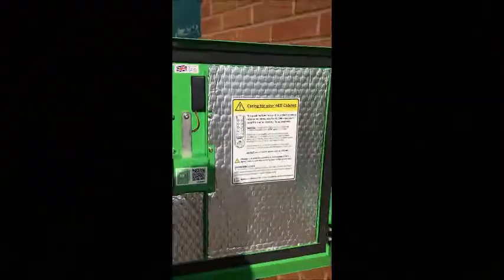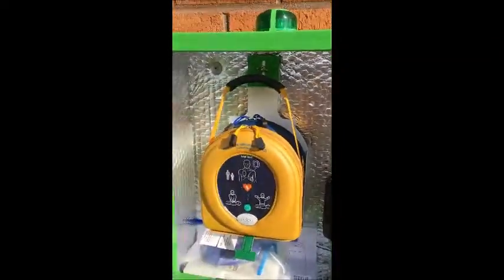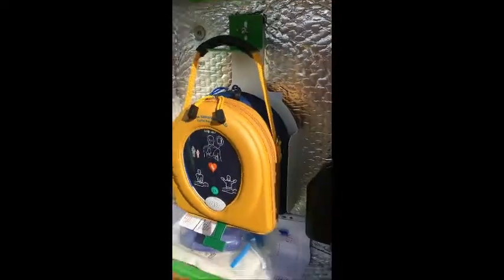So we're going to enter the code into the cabinet. You can see the blue light there which indicates that the cabinet is unlocked, so open the cabinet. First of all just take a general look to make sure everything's okay in the cabinet.